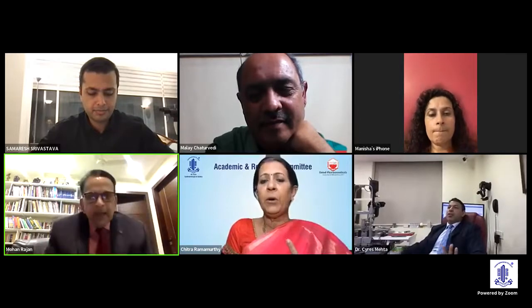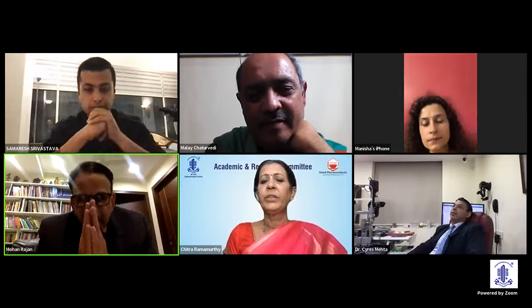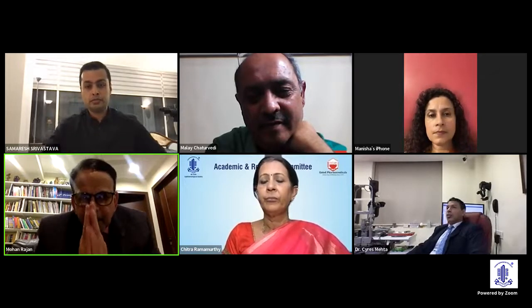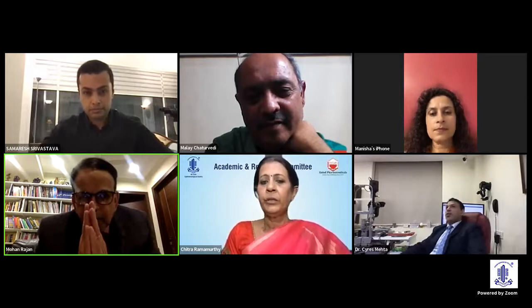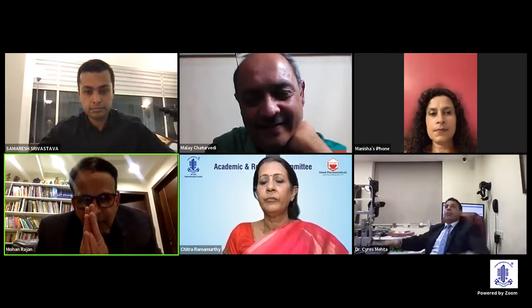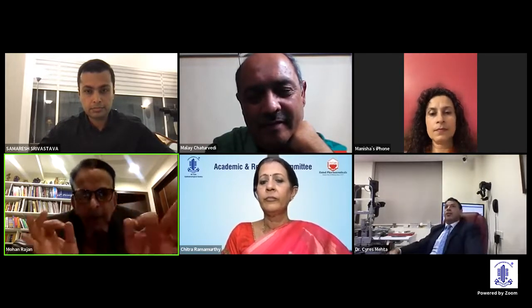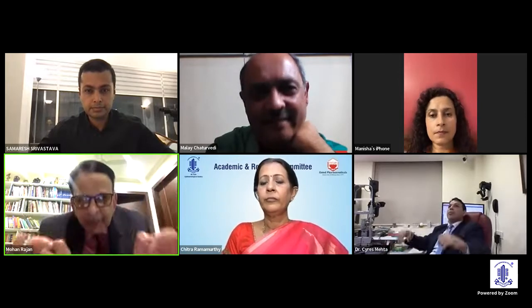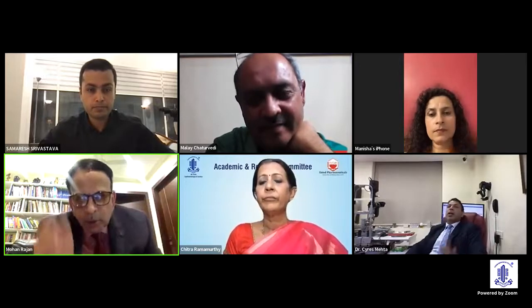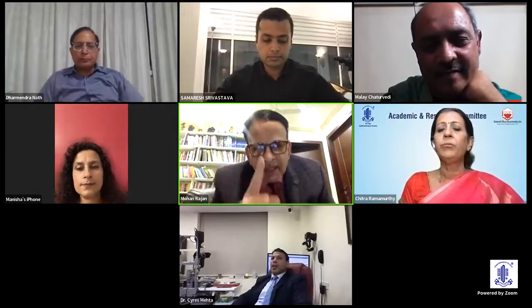What would you think? I think exactly right. This is a fantastic message I want to give everybody. When you have a PCR, don't be in a hurry to pull out the phaco probe, number one. Fill up with the viscoelastic. As soon as you fill it up, obviously the vitreous is going to be there. Put triamcinolone first, stain the vitreous and do a bimanual anterior vitrectomy, or you can go posterior vitrectomy, whatever you're comfortable with. But remove the vitreous first.